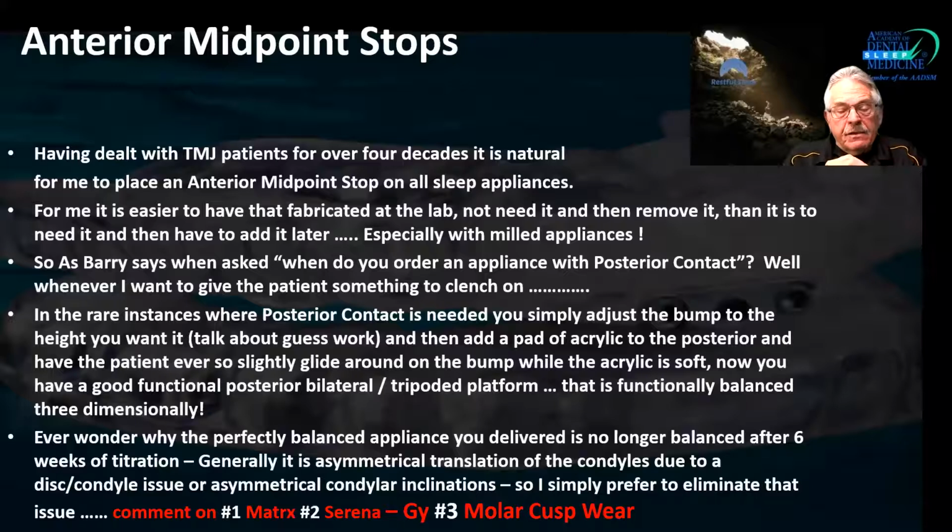I don't have evidence of this. I don't own a matrix, but I have heard people say this, that the compliance for patients that have their appliance designed with a matrix, again, I'm not experienced at this, that the compliance of wearing that appliance is a little bit better.